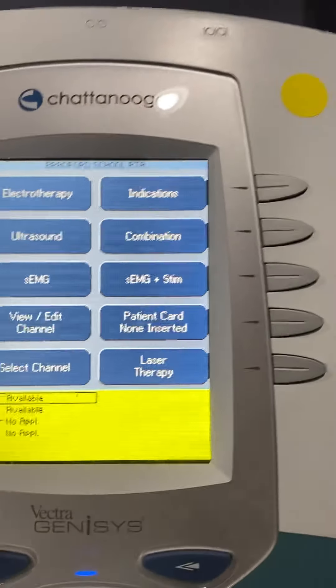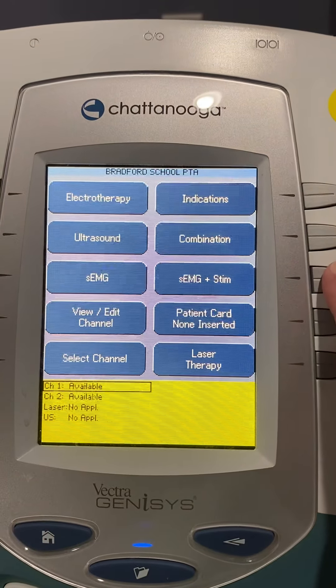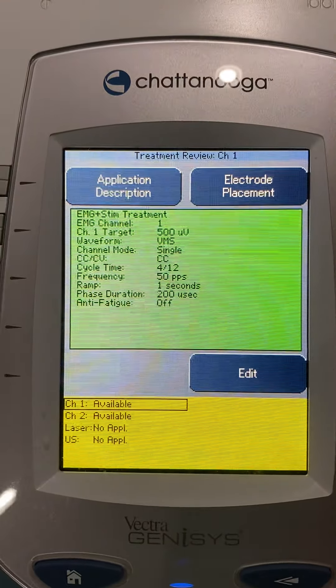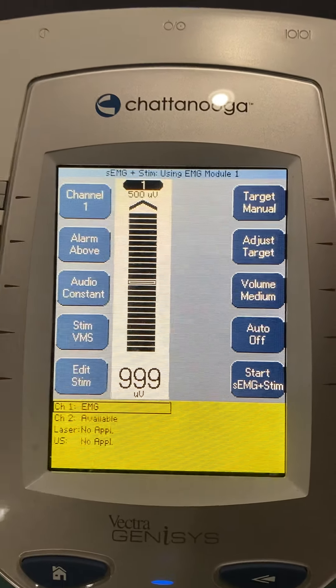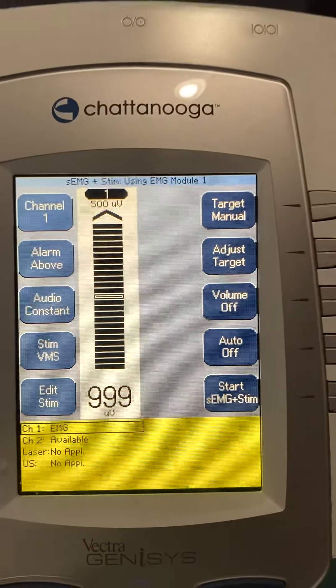We're going to be looking at biofeedback on the Chattanooga Genesis machine. If you pick the EMG stim, you will get biofeedback. We're going to edit so we can look at everything, and we're just going to have one channel. First, I'm going to turn the volume off while we talk.